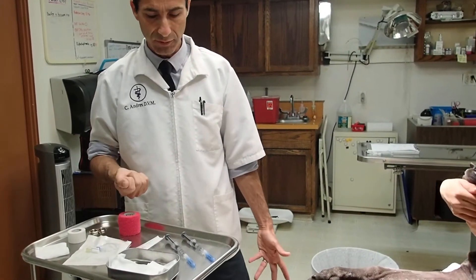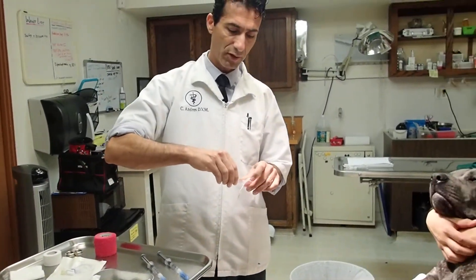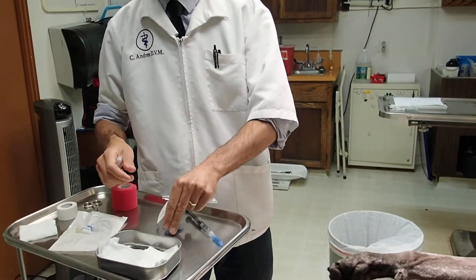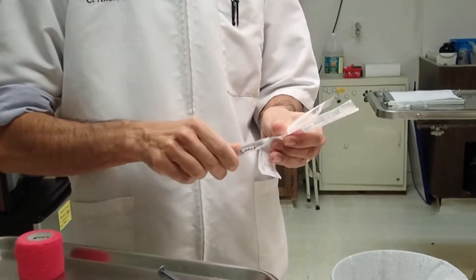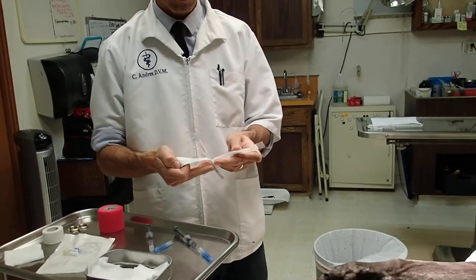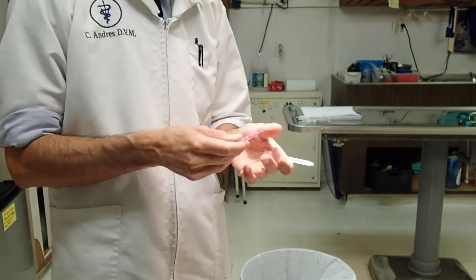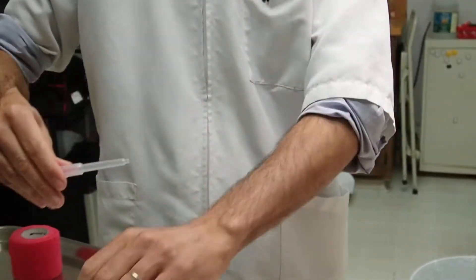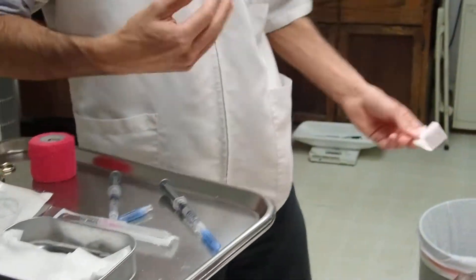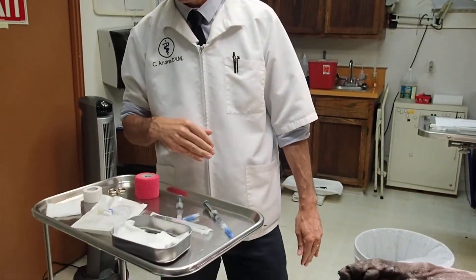So the first thing I'm going to do is take my intravenous catheter and pull off the filter cap — I'm just going to pull this off in a sterile fashion and set it aside so it's not touched. I'm going to go ahead and flush the catheter with the sterile saline. Then I'll pull out the catheter, not all the way — I'll take it out of its sheath and just make sure that the catheter itself is loose. I'll put this back in and set it inside the sterile bag that it comes in, so it's ready to go. I personally don't like to leave the cap in just because I feel there's more resistance to blood flow, so I just prefer no resistance at all.